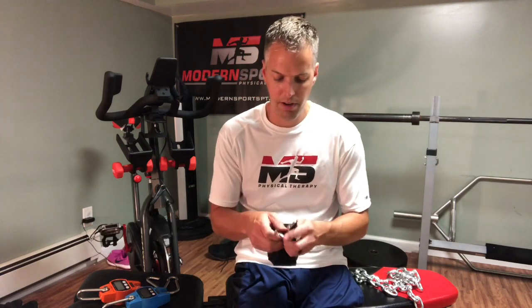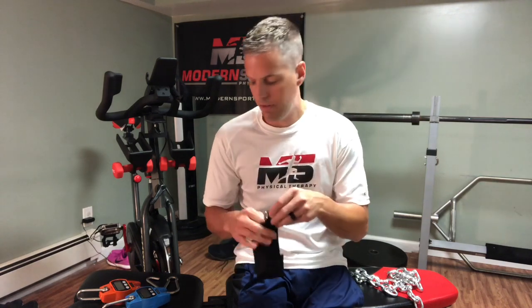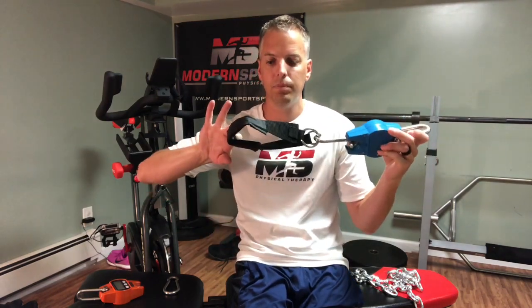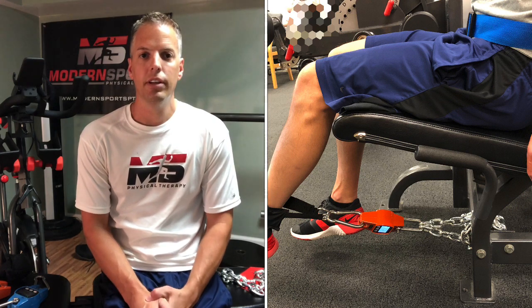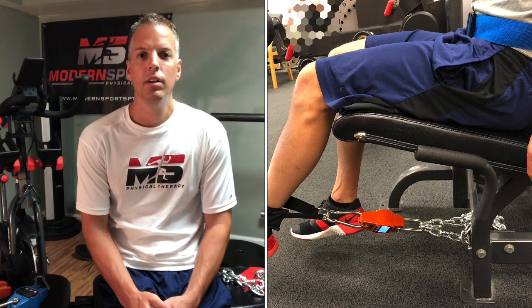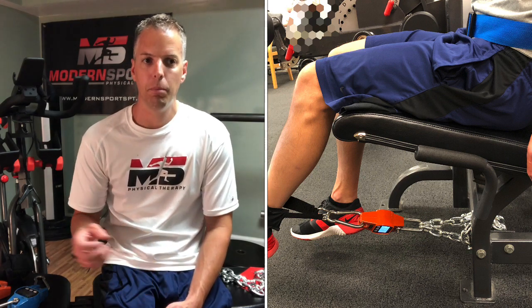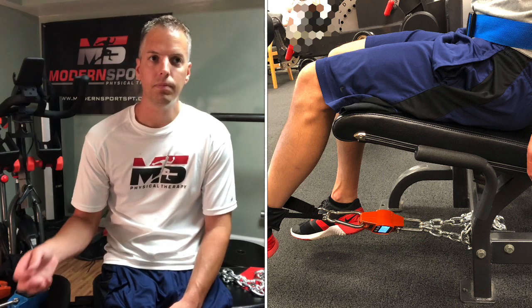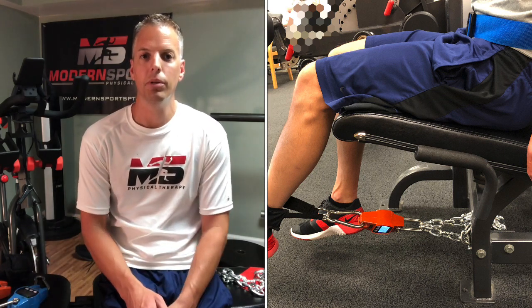On the other end, you need some way to secure it around the person's lower leg and ankle. This is just an attachment for a cable column — they make tons of these on Amazon. Looking at the full setup on the leg extension machine: the ankle strap goes around the ankle, then the hook or carabiner, then the hanging weight scale, then attach the chain. Using a chain lets you adjust the angle much more easily.